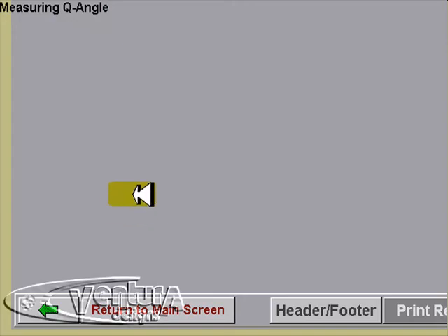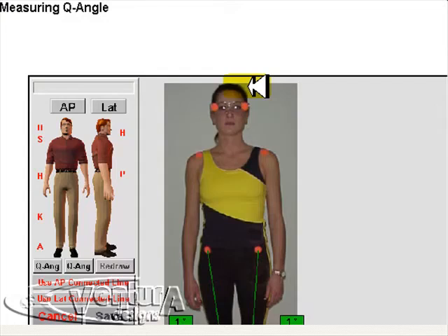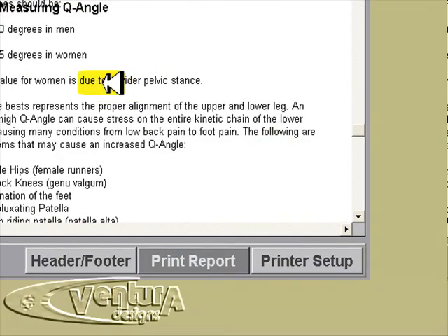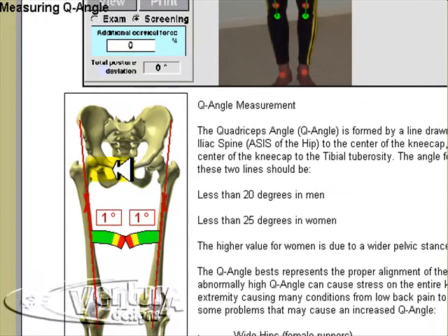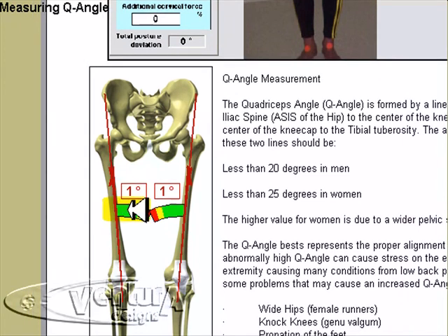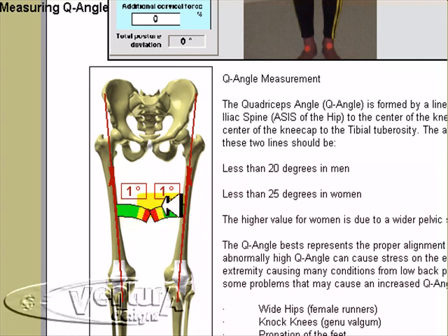This will generate a quick report that shows the person's Q-angle results in the top part of the screen. The bottom part of the screen shows a special Q-angle quick report with a skeletal diagram showing the angles that were generated, and a bar that shows safe zones, caution zones, and danger zones. This bottom part of the report will also print in a regular posture exam if you have enabled the Q-angle part of that report.